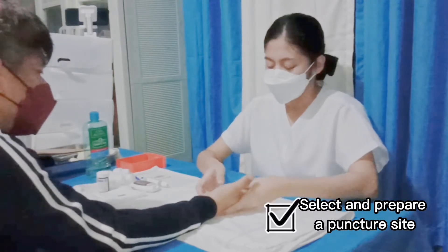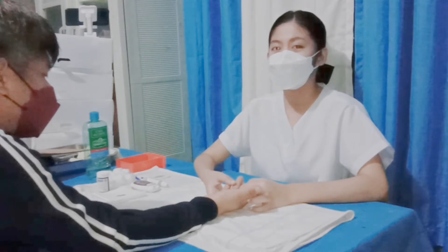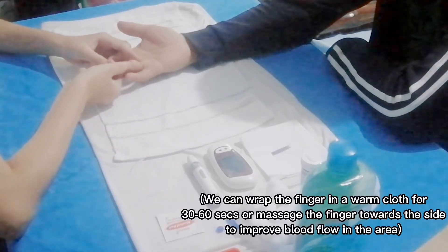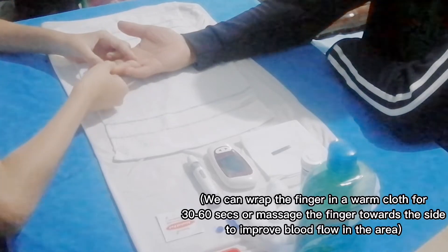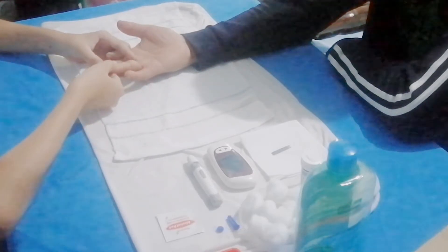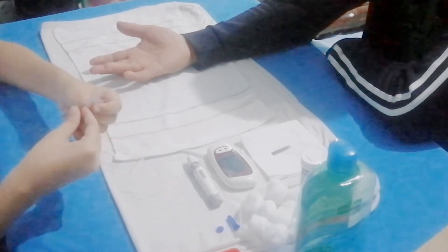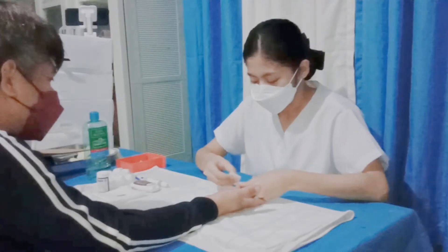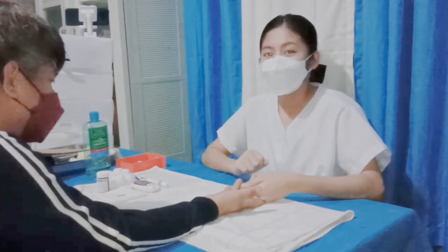After preparing the equipment, we may now choose the puncture site. Sir, can you please give me your hand? After choosing the puncture site, we are now going to massage the finger towards the side to improve the blood flow in that area. Next, I am going to clean the site using an antiseptic swab.